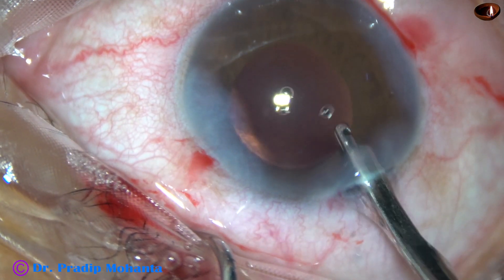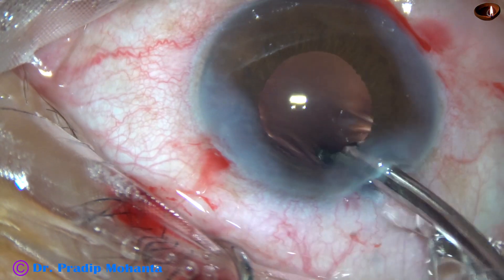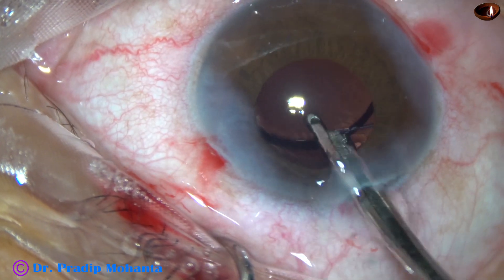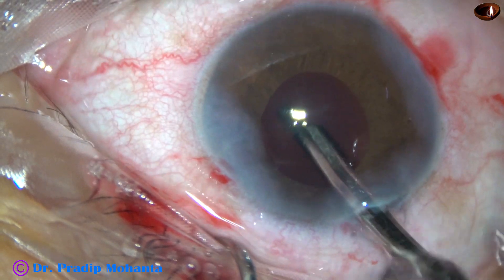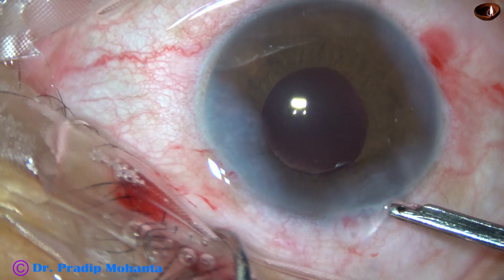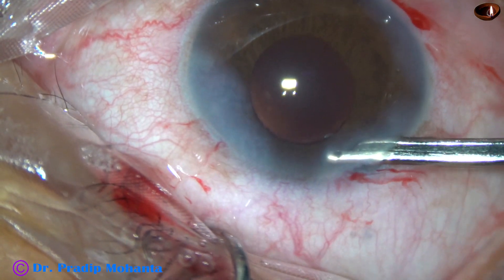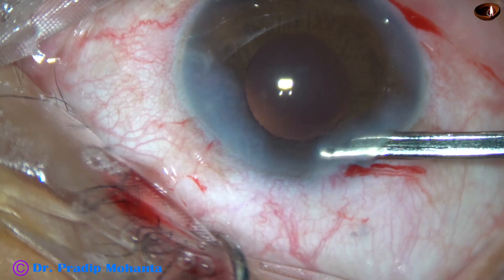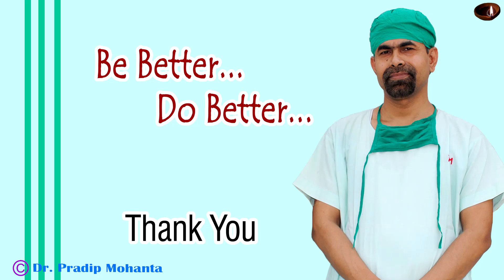This is the final lavage of the anterior chamber. I irrigated the capsular bag and removed all the viscoelastic from the anterior chamber and capsular bag. The anterior chamber was formed very nicely, and the case was concluded. Thank you very much for your attention. I hope this video will help you in developing your surgical skills.